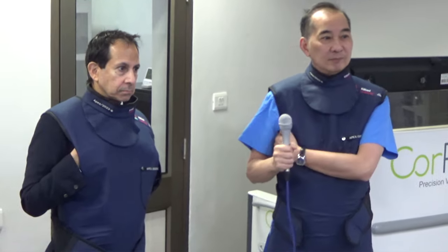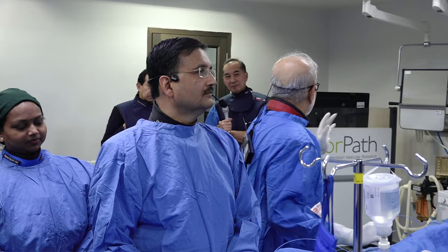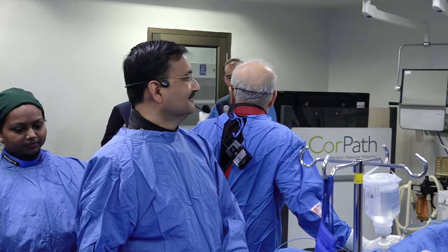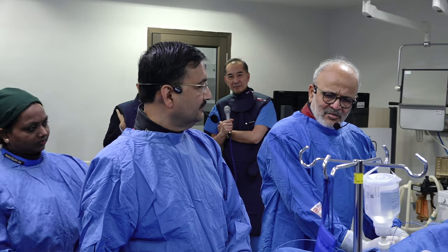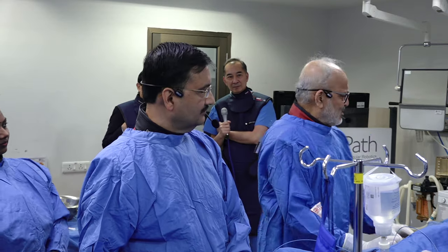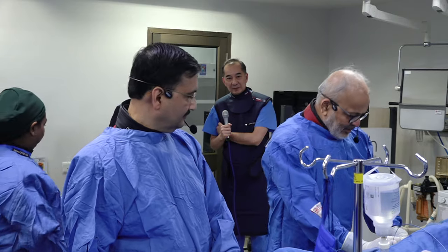But I know some laboratories are equipped so they can flip the image. Yes, every cath lab can flip the image. Do you do that now? No, I'm not going to do that. But still, if you're going to face some problem with cannulation, that will give you a sort of deceiving comfort that you are working in a levocardia situation, but it may not work that way. In our career, Sanjay, we must have done maybe 7, 8, or 9, still not in double digits. But we have done it periodically.